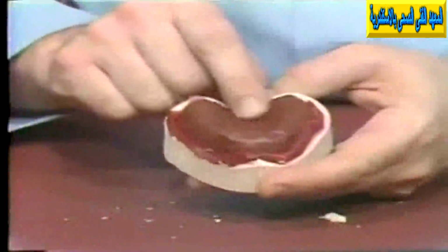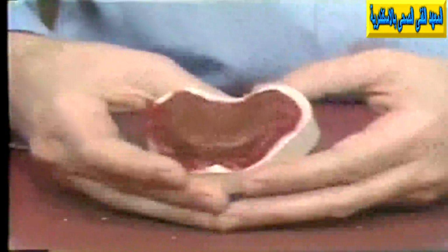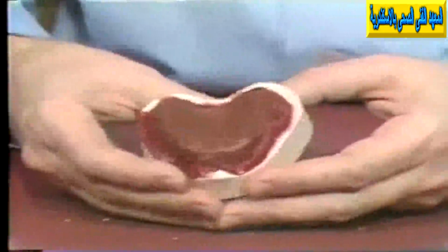If we're using an acrylic resin tray, such as you will on the lower, if we have any undercuts, it's not quite as simple as putting it in cold water. And what we do there is simply remove all the wax and ignite the acrylic resin base. And it will flame and become soft. And then we extinguish the flame and simply pry off the acrylic resin base. It will become very soft at that point. But the compound, all you have to do is lower it in some warm water.